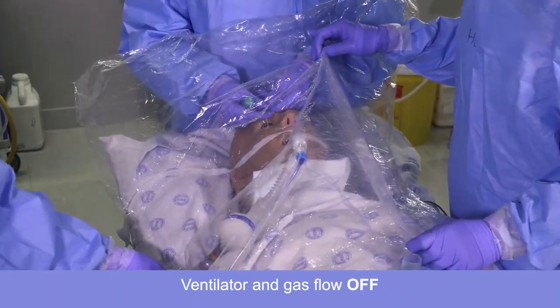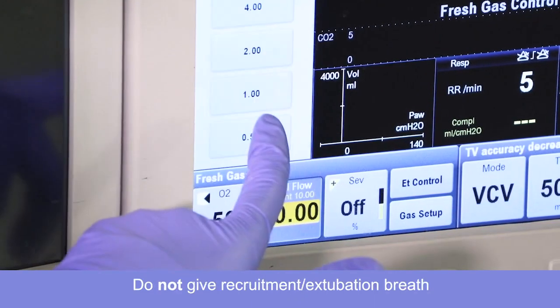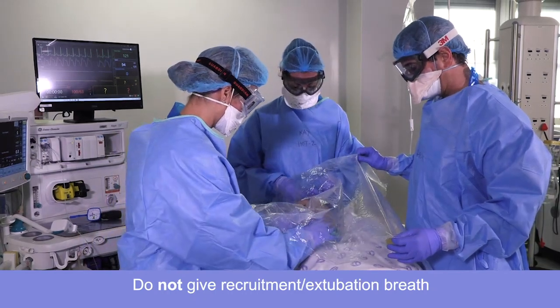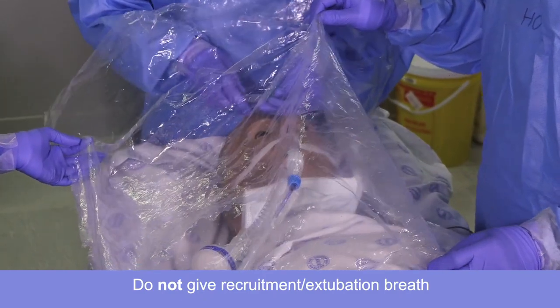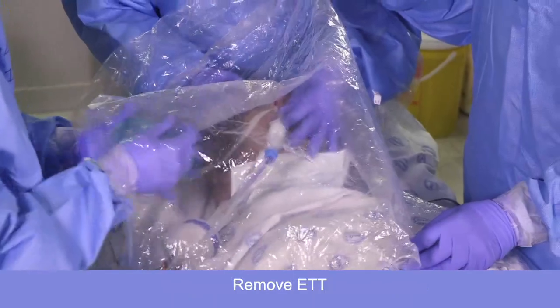Let's turn the ventilator off and the flow is off. Ventilator off, oxygen off. I'll hold the sheet. I untied the ties. Deflated the cuff. Deflated the cuff, and straight with the mask on.